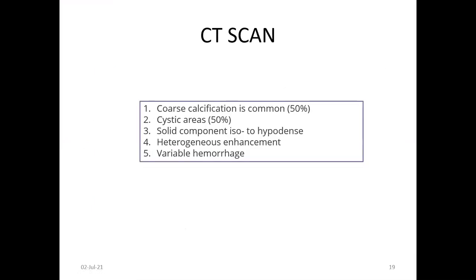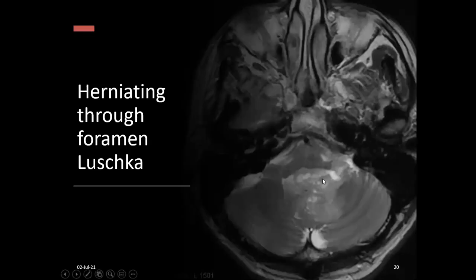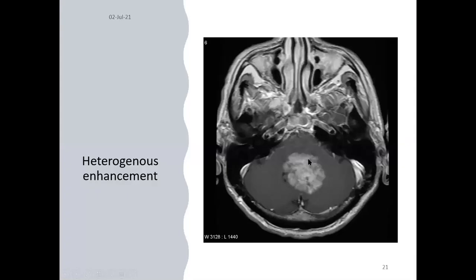On CT scan, coarse calcification is common, seen in about 50% of cases. Cystic areas, solid components, heterogeneous enhancement, and variable hemorrhage may be present. Here is a posterior fossa fourth ventricular ependymoma extending through the foramen of Luschka — this is consistent with a posterior fossa group A tumor. There is heterogeneous enhancement with hemorrhage, cystic changes, and calcification.